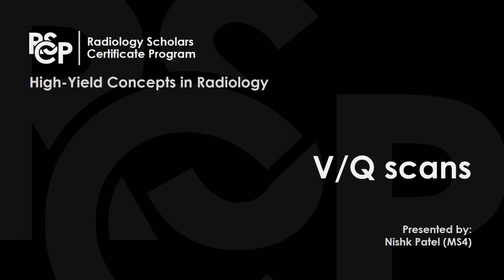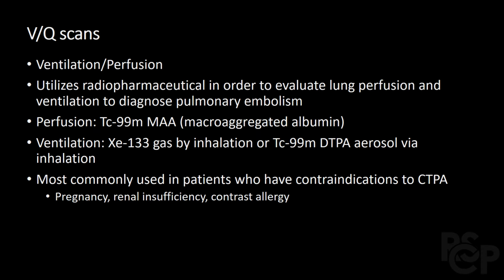Today we're going to be discussing VQ scans in nuclear medicine. VQ scan stands for ventilation over perfusion. They're one of the common scans utilized in nuclear medicine. They use radiopharmaceuticals in order to evaluate lung perfusion and ventilation, and they're commonly used to diagnose pulmonary embolism.